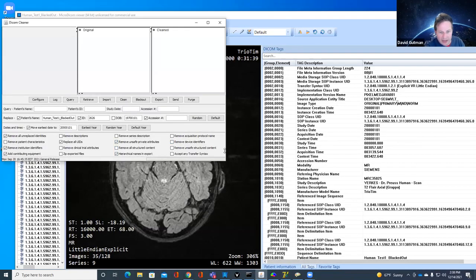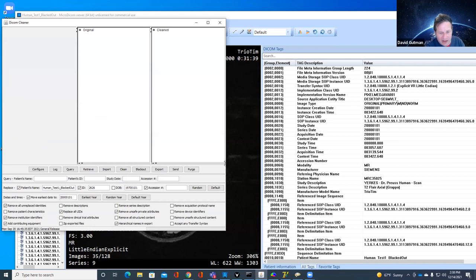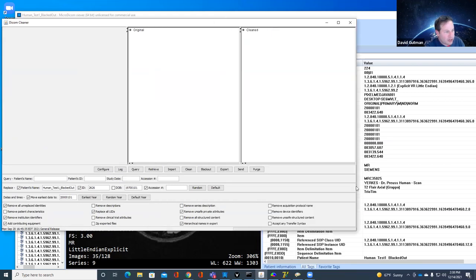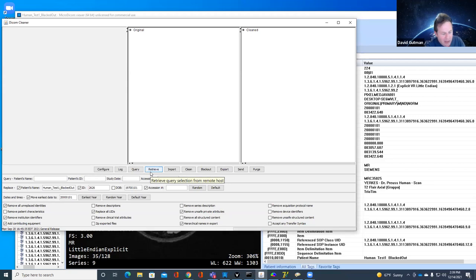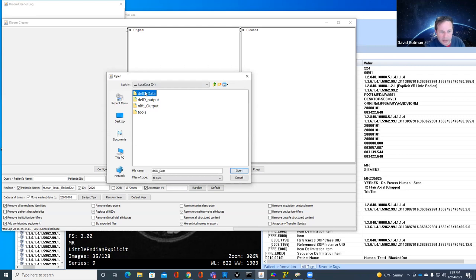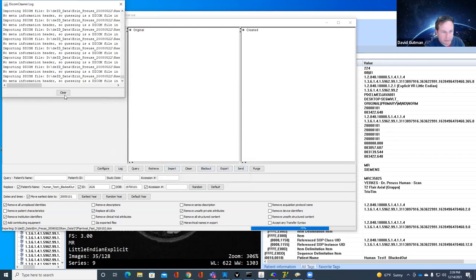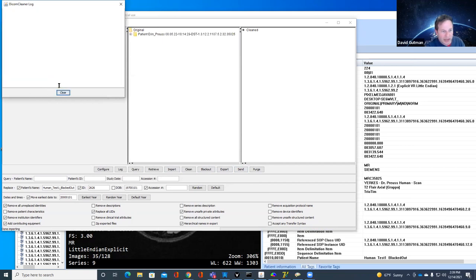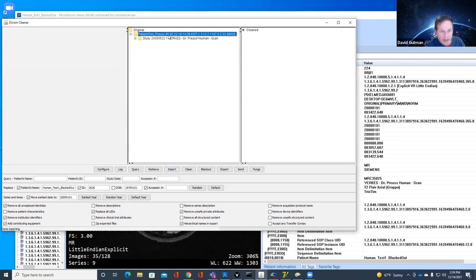Now I'm going to use Dr. Clooney's DICOM Cleaner, because it's the only thing I found that's GUI-driven and also allows you to not only block out the common metadata fields, it will also allow you to remove some of the burnt-in text. It's quite easy to use — I import a scan, go to local data, hit open, the scan is imported, and I can double-click on it.